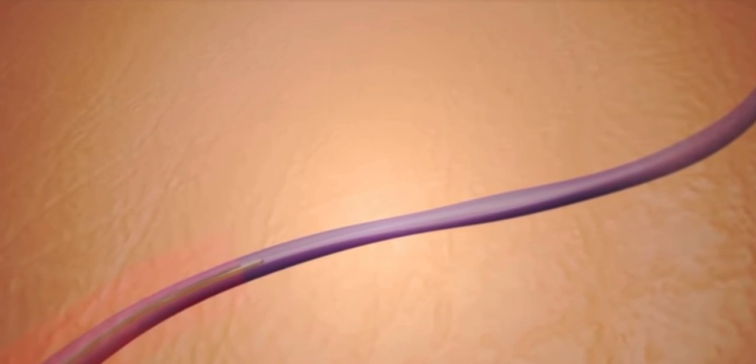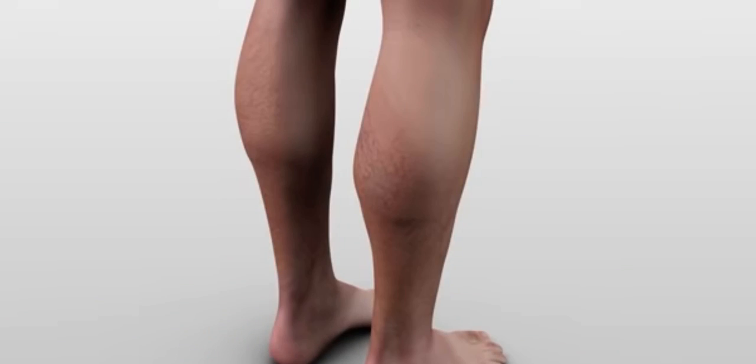Once the vein is collapsed, it is eventually absorbed by your body. Afterward, the blood flow is diverted to healthy vessels.